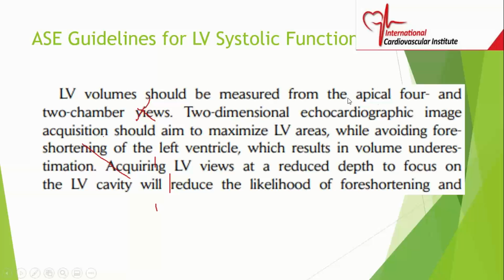LV volume should be measured from the apical 4 and 2 chamber views. Two-dimensional echo image acquisition should aim to maximize the LV areas while avoiding foreshortening of the left ventricle, which can result in underestimation.